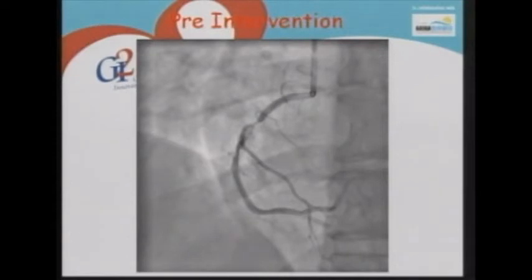The right coronary is also interesting because, as was mentioned by Dr. Costa, it's a tight lesion, but then there's this long shoulder. So the actual disease is over a long segment. So I think with a scaffold like this, you'd want to cover pretty much normal reference to normal reference. So you'd be using a longer device than this lesion, is what my guess would be.